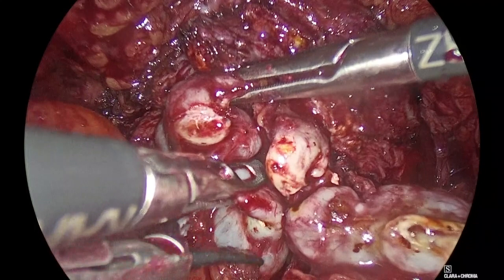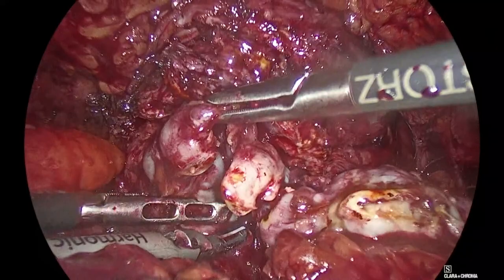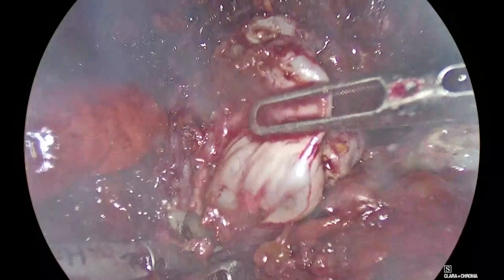Transperitoneal, you can do it by yourself. When you do a pyeloplasty, as I did yesterday, or a nephrectomy, you need the guy holding the camera, but you could really do it by yourself. But prostatectomy, it's another game. Hold here, Panagiotis, the vesicle. Good. Up. Is this a 0 degree lens you're using? This is a 0 degree lens, yes. I always use a 30 for transperitoneal surgery and a 0 for extraperitoneal.